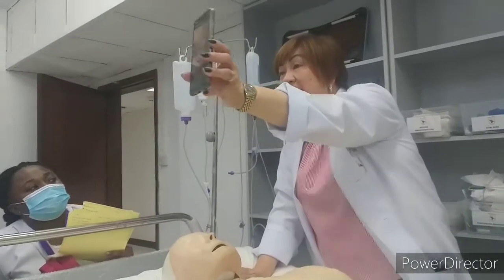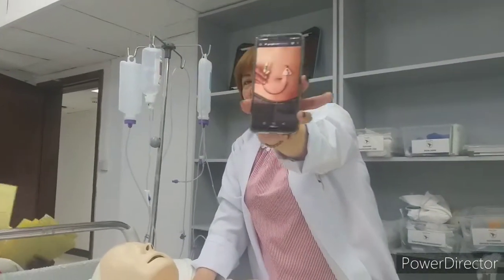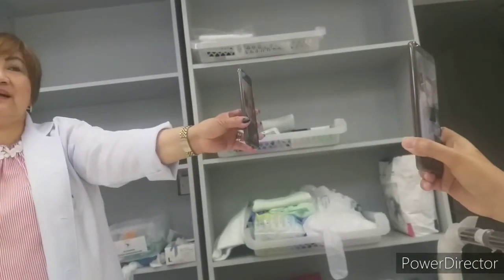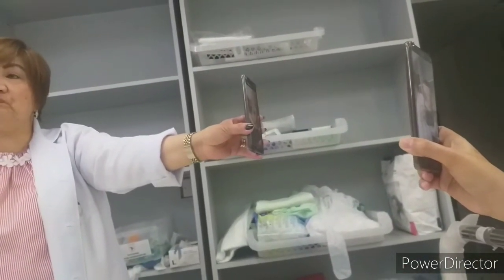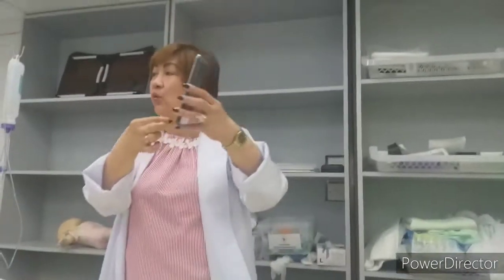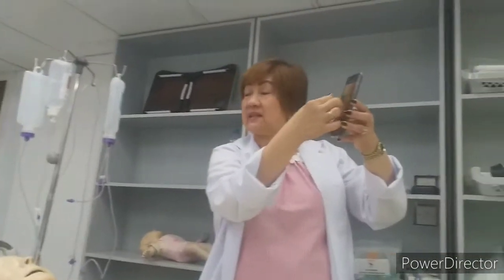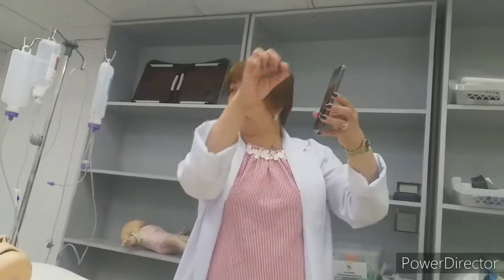Okay? Keep it clean. Okay? Only that part surrounding the tube. Okay? But with the tube itself, just clean with the normal saline. Okay? The tube itself, if it is dirty, just wipe it with, not the antibacterial, huh? So only the saline. Okay?